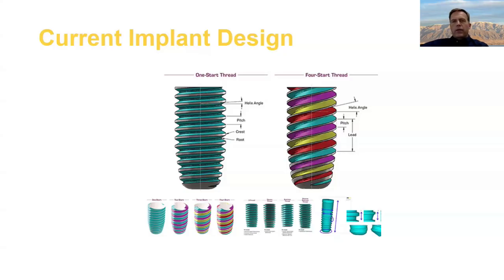Another thing that's really important, that I maybe see more as a dental technician, is how long an implant will last. My first exposure to dental implants was a little bit in the lab, but my mom got dental implants in the early 90s, and she still has both of those. And lucky for me, they're original Brånemarks, so I can still get restorative components. But one of the more frustrating things in dental laboratories is when we have a perfectly healthy implant that we can't get restorative parts for because the company has gone out of business or whatever. And so sometimes we'll tell the doctors, well, why don't you try to cut it off and save the abutment, because we're really going to be out of luck if we have to go to the fixture.